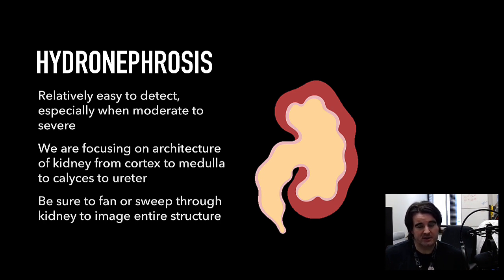We generally scan kidneys in the conventional coronal plane, but also usually in the transverse plane, that's along the short axis of the kidney as well, to make sure we have a solid amount of acquisition. If not done well, you may in fact incorrectly identify a cyst and think that you are detecting hydronephrosis. But on closer inspection, you will likely be able to discern that it's not collected to the renal pelvis.